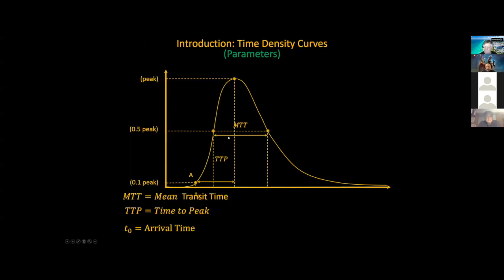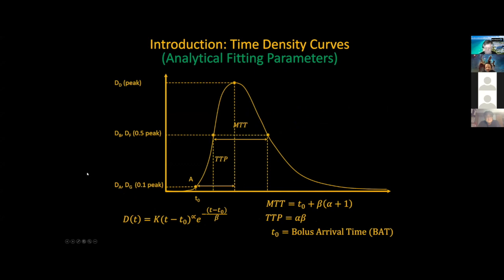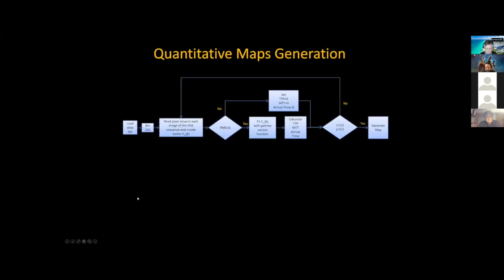And we measure these quantities, which are very common for the people that do CT perfusion to evaluate stroke: mean transit time, time to peak, peak height, etc. Mathematical formulas are given here. We're kind of old school in this one. We're using the gamma variate functions. In CT perfusion now, the more advanced techniques like SVD plus and Bayesian algorithms are used to evaluate those flows.